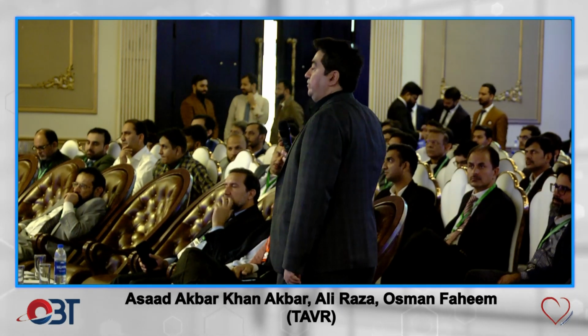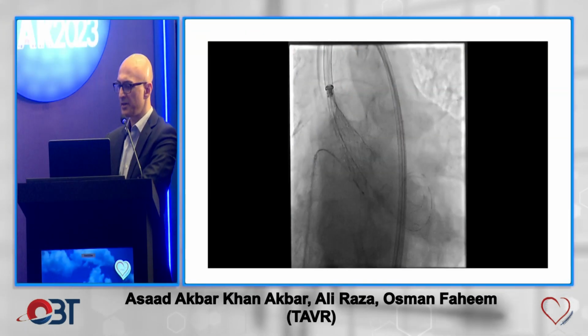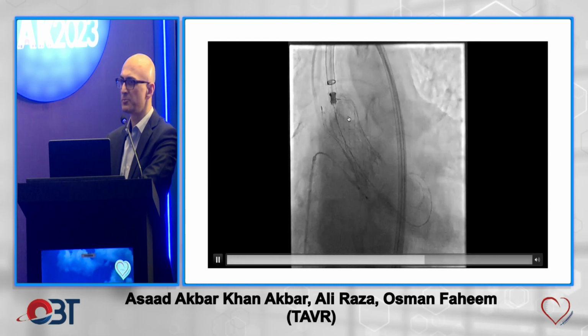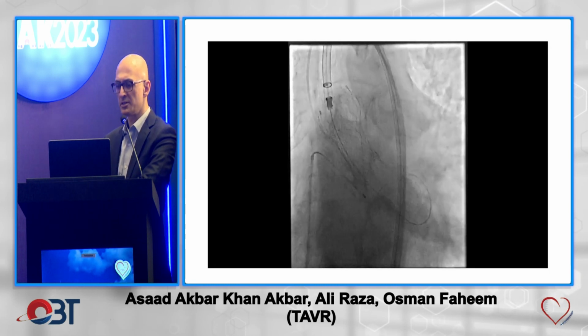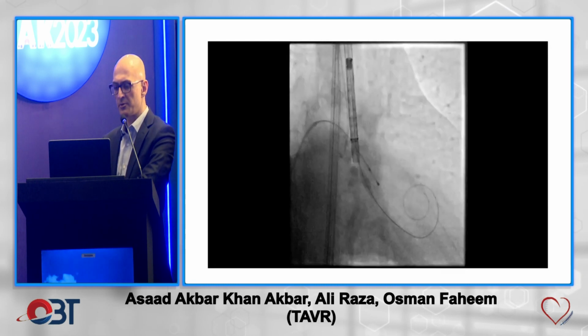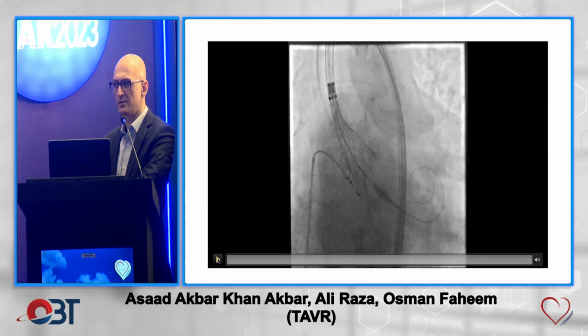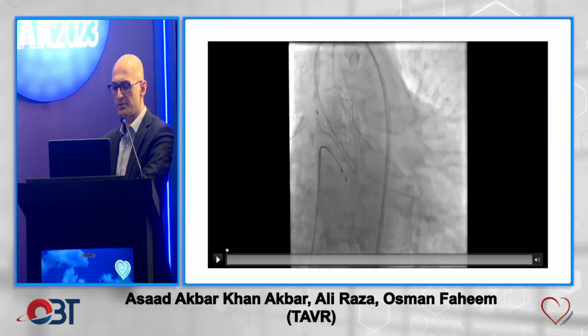And so interesting to note where this valve ended up. And remember this angle, and look at this angle when we were positioning the valve. So you have to be able to kind of predict how the valve is going to sit and which way it's going to shift. You can't always predict it, but it helps in your valve positioning.